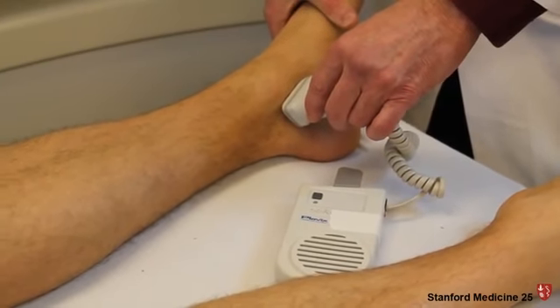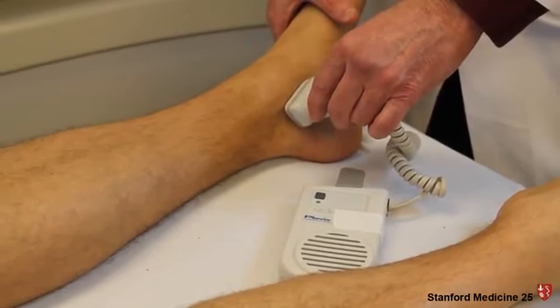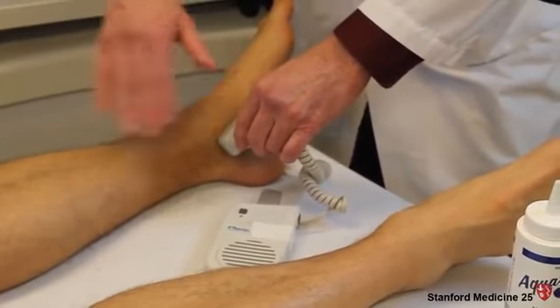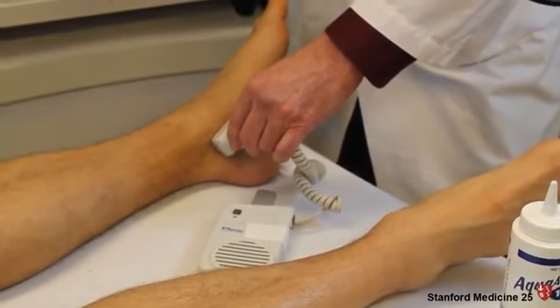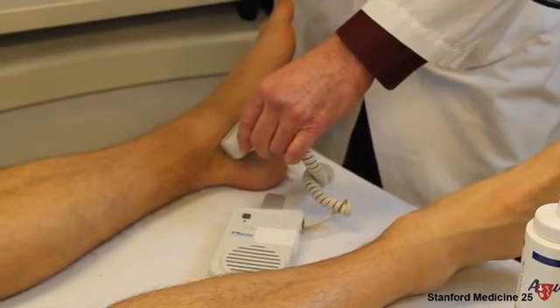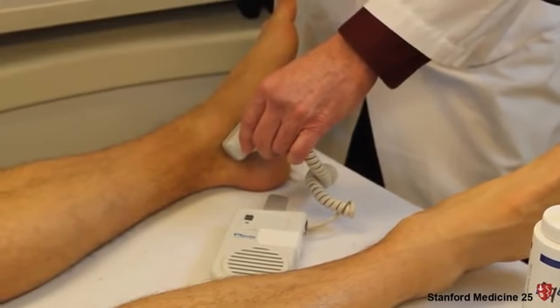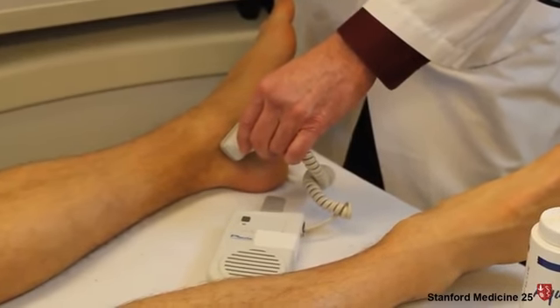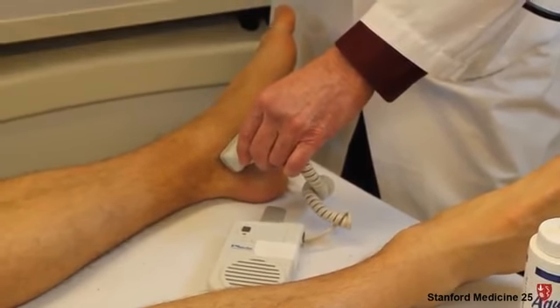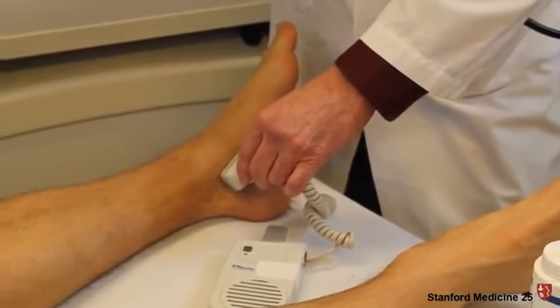What you just heard was venous return being augmented by compression of the foot. And that tells you that at least in this immediate vicinity, the venous return is normal. There's no obstruction. You want to move up the leg and do the same thing over the popliteal space. Listen for the popliteal artery, and again do compression, this time of the calf, and you should hear a robust signal, venous signal, if the individual has an open venous system.